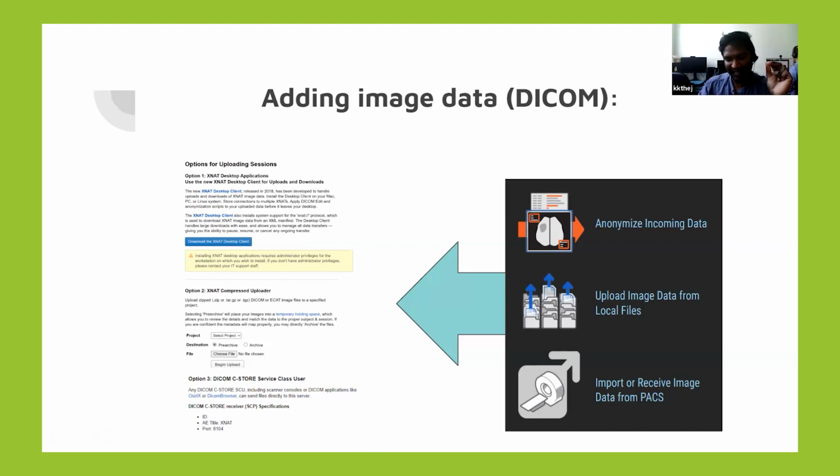Pre-archive is a staging step to check whether your data is properly organized in the folder before you upload it to a project. So we have this great option to see what we are uploading and check how the data is organized just before it uploads into XNAT. You can even change the subject, or move a scan from one subject to another.